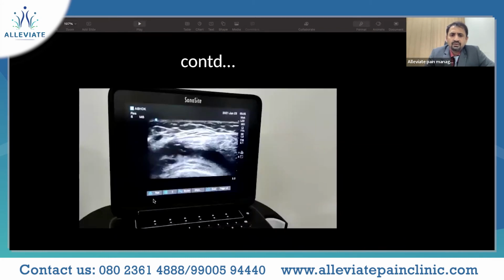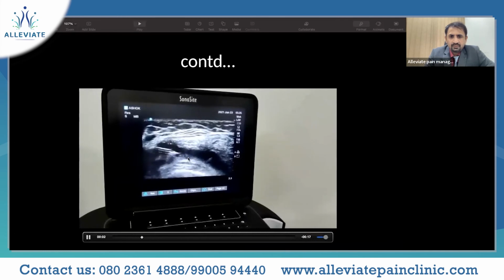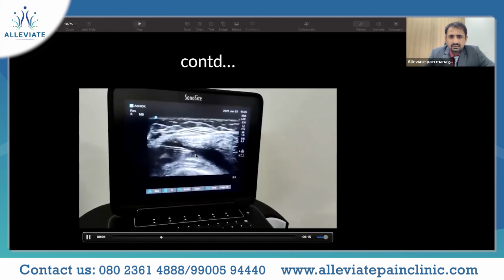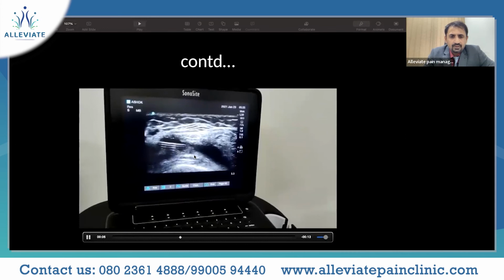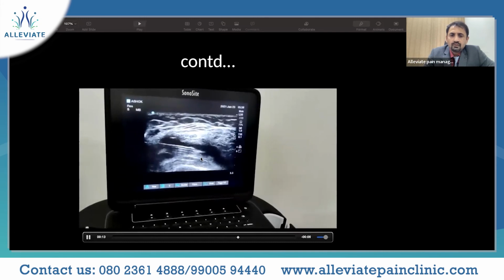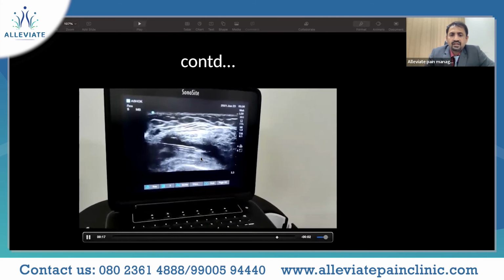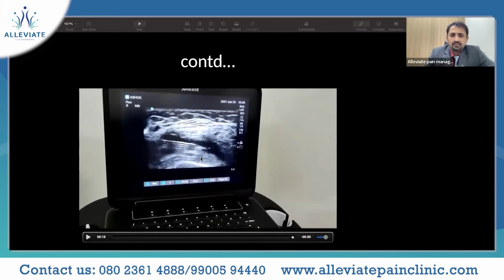There's again a video in which you can see the bigger bore needle and synovial thickening. That's the reason why I placed it. You can see that cotton type of way the synovial thickening looks. It's always better to aspirate it, send it for analysis, and then you can also deposit whatever you are planning for.